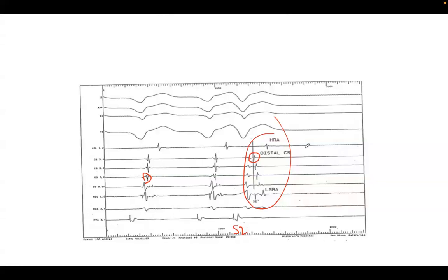This one didn't capture. I'm sorry, I was getting some food. Okay, so this is your S2, this is your pacing spike and there is a QRS, right? It captured. Yeah, I captured. Okay, and then you see A that is earliest at 3-4 versus here A is earliest at 7-8, right? There is a discrepancy, the question is why?